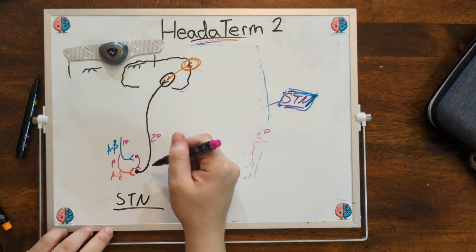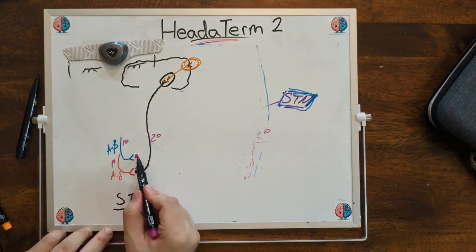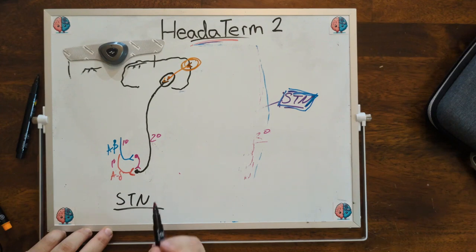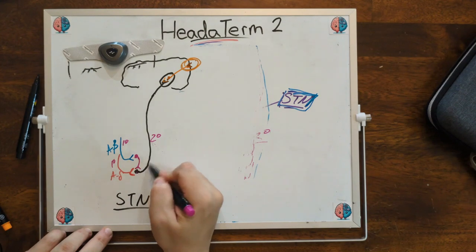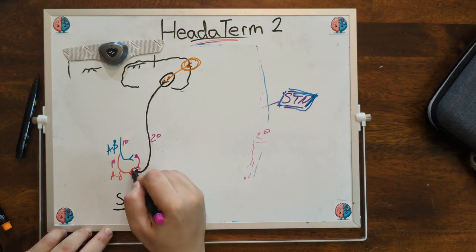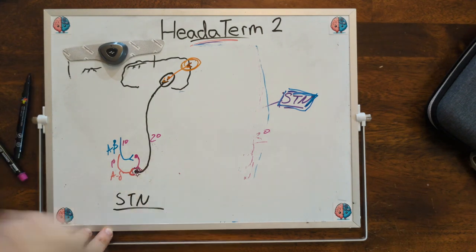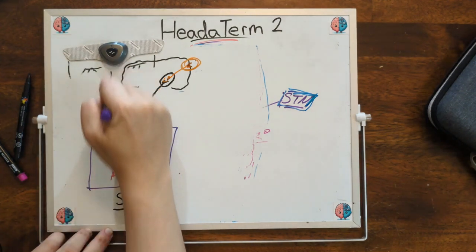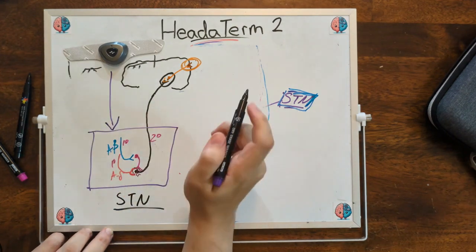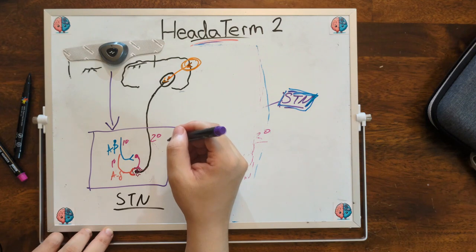And how do they do this? Via an interneuron. An A beta fiber sends a signal to an interneuron that synapses with a second order pain neuron. It releases neurotransmitters like GABA to dampen the signal of the second order neuron. And this is the first line of defense for headache pain. This occurs in milliseconds of the initial stimulation.